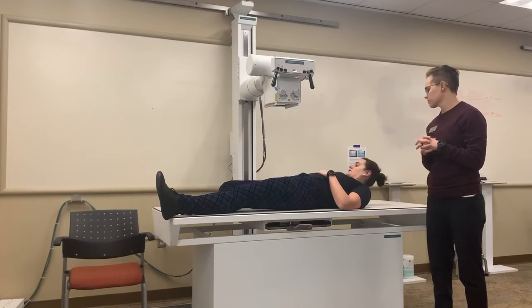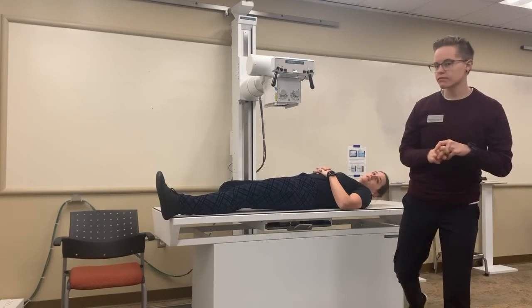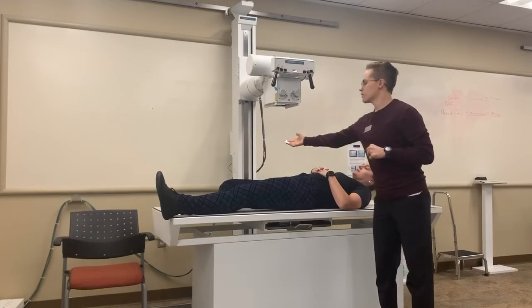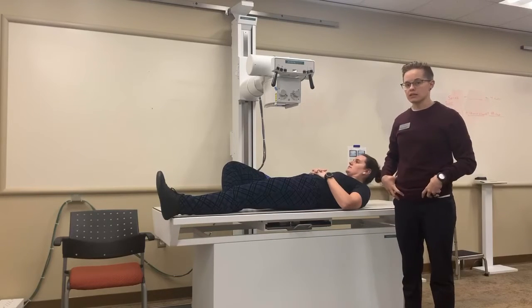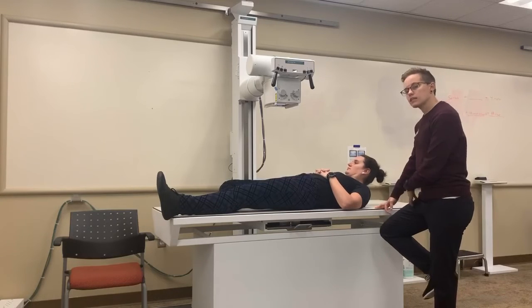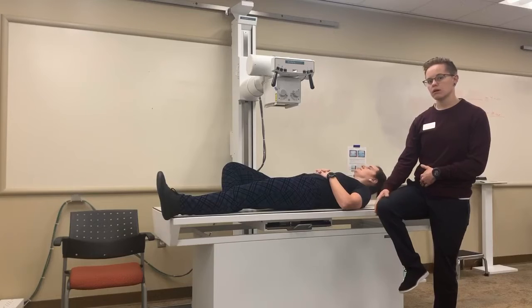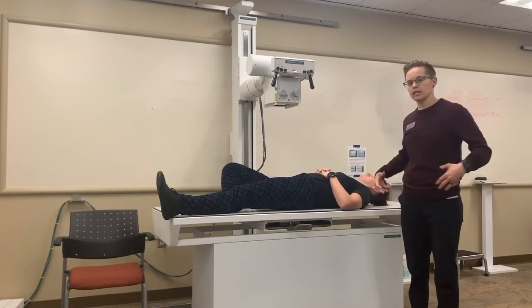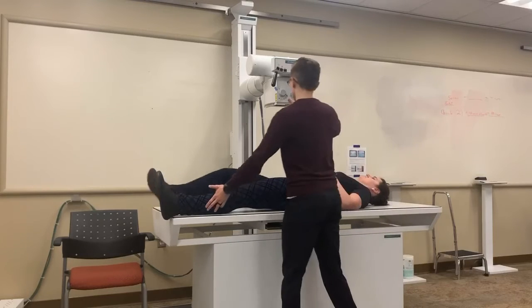What if my leg doesn't externally rotate this far? If you can't externally rotate that far, we would get a foam wedge and put it underneath the knee. I want the pelvis to be flat. So if they can't comfortably externally rotate and they flatten their leg but their pelvis comes up, you compensate by putting the foam underneath that knee so pelvis stays flat. Okay, you can relax, straighten your leg for me again.